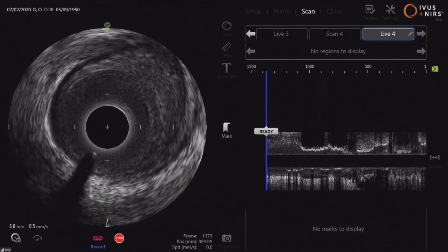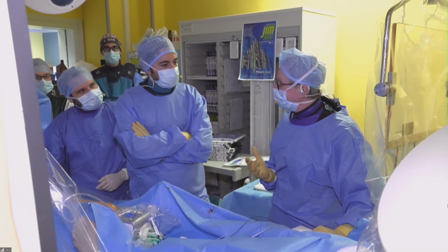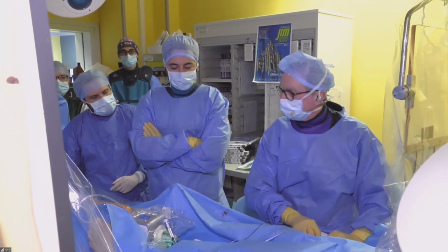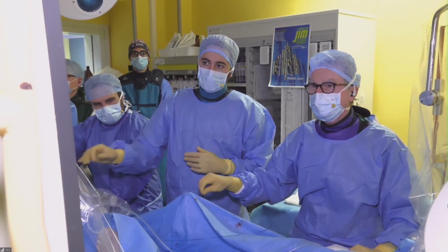So, you know, I know the trial, but that type of lesion with that lumen, calcific, I think should be left alone. But we have to do the trial, we have to do it. But, you know. Okay, let's get a balloon.